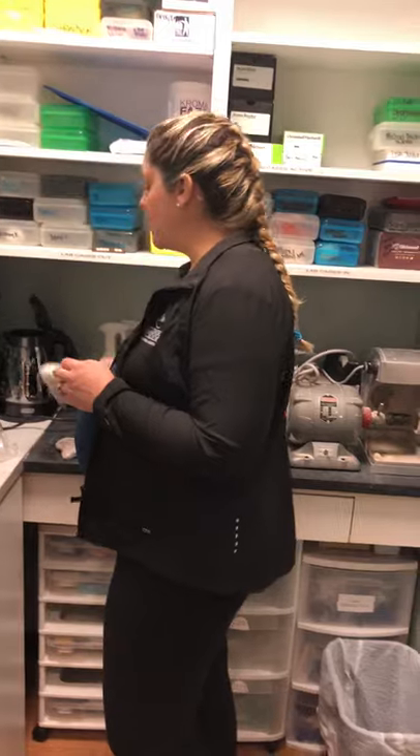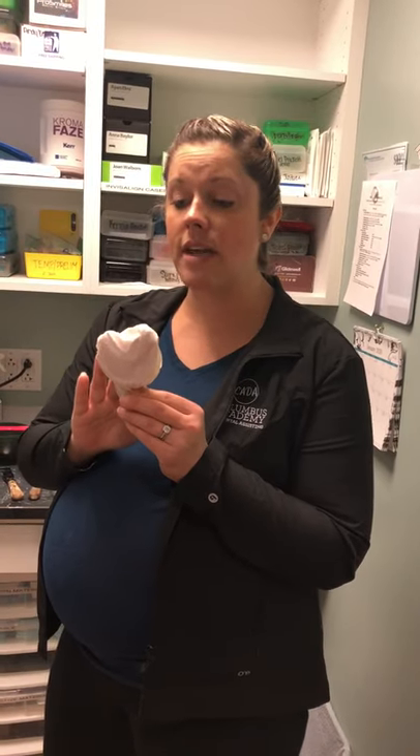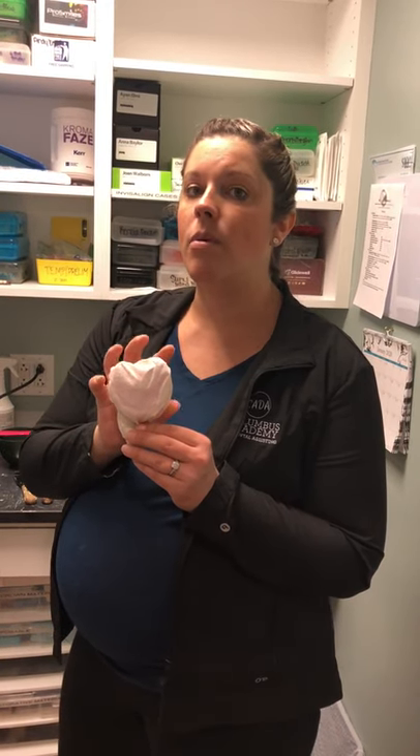Another thing: when you're done taking your impressions, if you're not going to be pouring them right away, make sure you wrap them in a damp paper towel. This is going to prevent them from distorting, because the alginate will dry out. You want to keep it moist until you're ready to pour it up with stone.